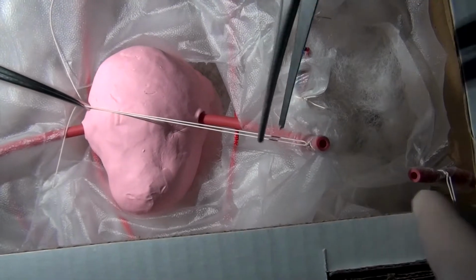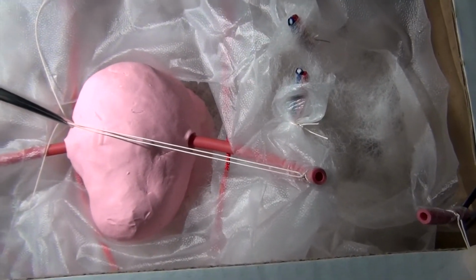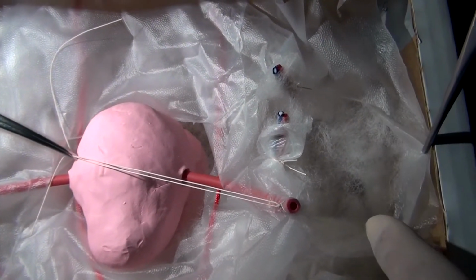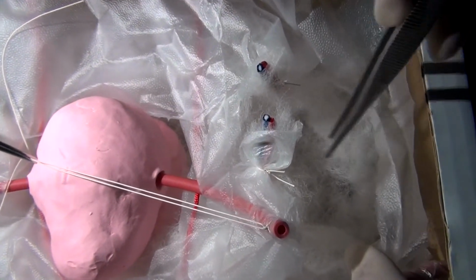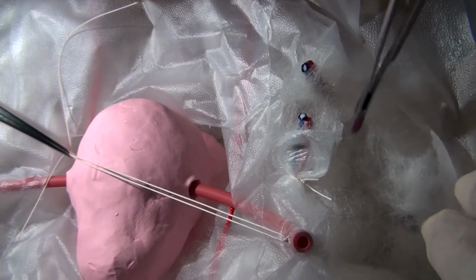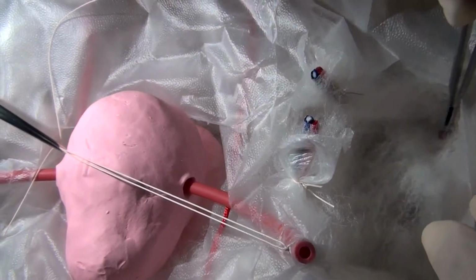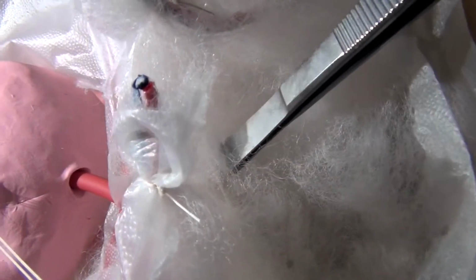Just to reiterate, we divided the round ligament laterally, closer to the insertion at the inguinal canal. We were able to tent up on our posterior sheath of the broad ligament in order to open up lateral to the pelvic sidewall, spreading, whether it's with your fingers, a Kittner, or the back of your forceps using suction. We were able to identify our ureter, which is here.